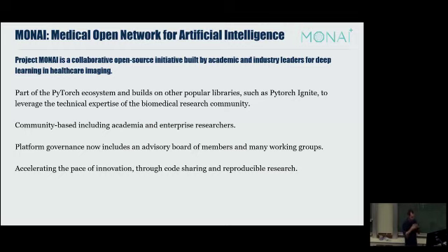So basically, it builds on top of PyTorch using other modules such as Ignite for organization, doesn't really matter, but it doesn't reinvent the wheel. When the wheel is there, we spin it as much as we can. But when we've got a missing wheel, that's where MONAI is kicking in. We are putting all of our community and medical image community expertise and know-how within MONAI, because we've got specificity, which makes a medical image different from a photograph of the street.